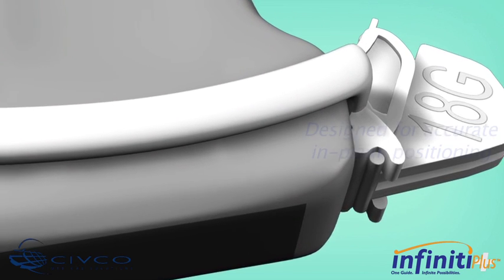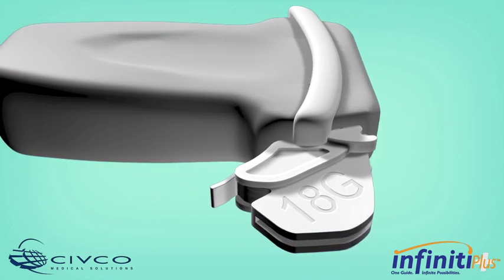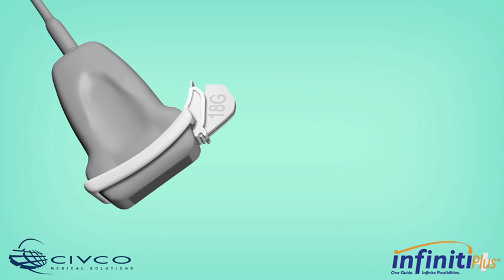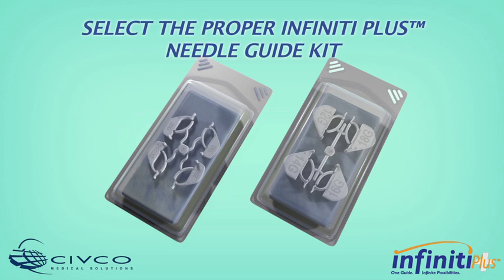Infinity Plus Needle Guides are designed for accurate in-plane positioning during procedures where access is difficult. The Infinity Plus Needle Guide provides a safe, reliable, and efficient tool for ultrasound guided puncture procedures. Each needle guide is conveniently packaged in a sterile procedure kit.